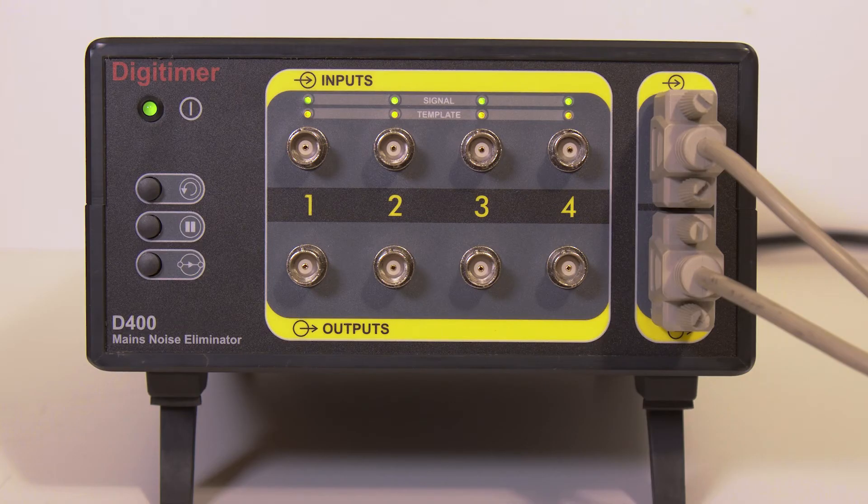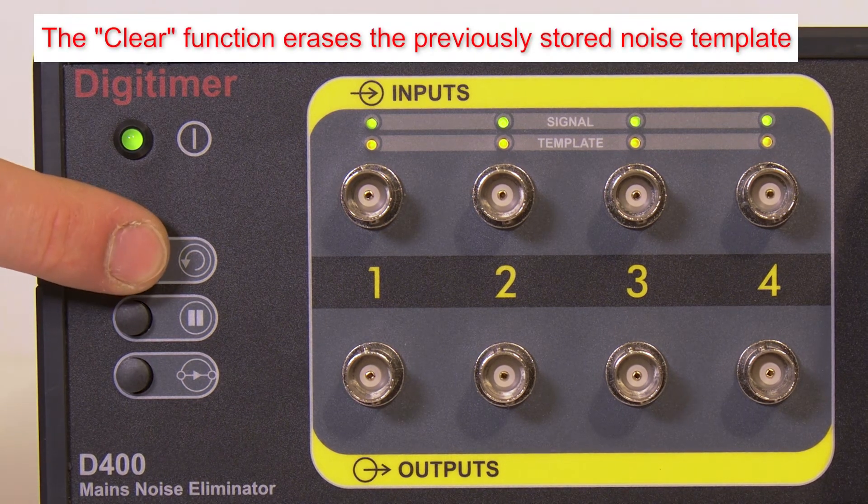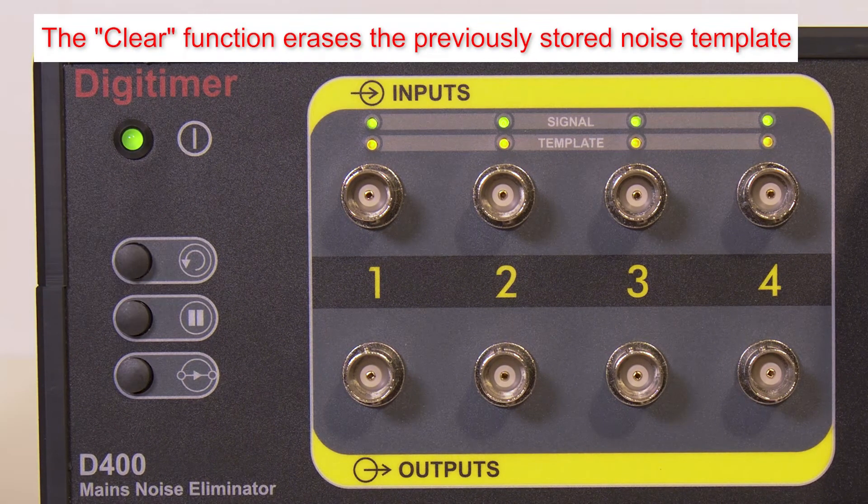The D400 has three front panel buttons. At the top is Clear, which wipes any previously constructed noise template from memory and forces the D400 to rebuild the template over the next few seconds. Pressing this button will lead to mains noise reappearing in the signal for a short time until a new template is constructed.